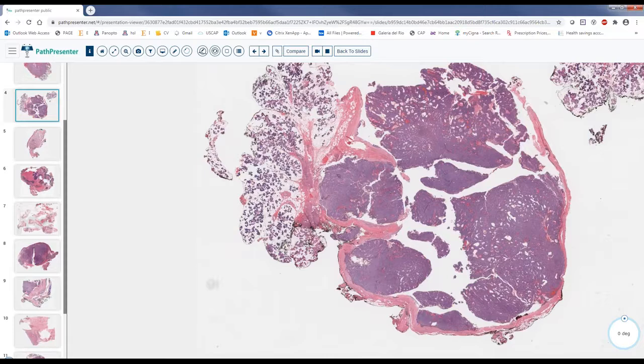Yeah, Fatima will ask that very important question. This is the CTNNB1, in other words, it is the beta-catenin. So the immunostain you do is beta-catenin, and you want to see the nuclear staining, nuclear translocation of beta-catenin. Okay.